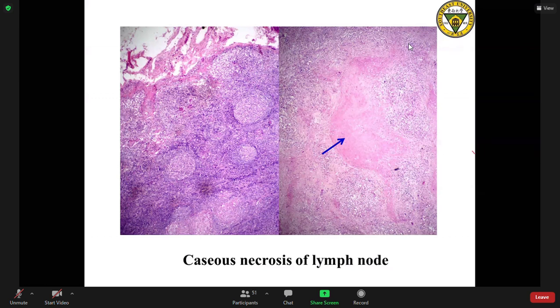It's a granuloma formed in the lymph node, and the given name is tubercle. It means many macrophages proliferate and some epithelioid cells combine into nodules, also named granuloma.